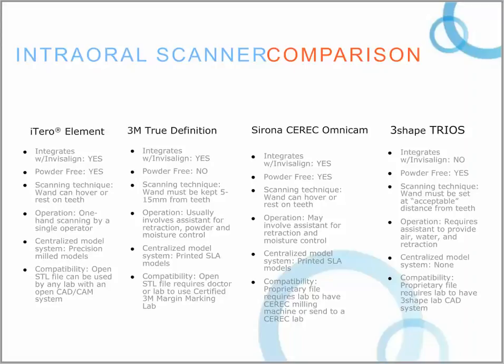Now, let's take a few minutes just to look at a comparison between intraoral scanners. And I don't mean this by way of a comparison that points fingers at good or bad, but just by way of things that actually are what we have now to work with for the different scanners. I'm going to use the iTero Element, the 3M True Definition, the Sirona CEREC OmniCam, and the 3Shape Trios.